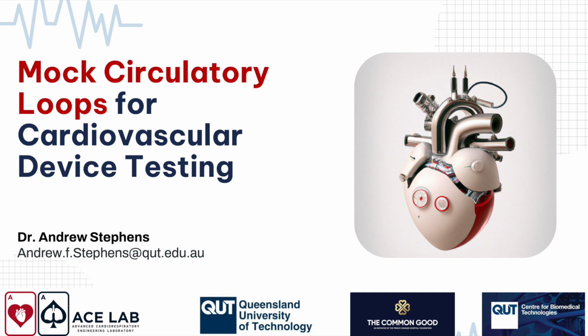But the key thing is to make sure that you pick one with a low pressure drop, because otherwise you'll be losing a lot of the work that the heart is doing across the valve, and that energy won't be transferred to the body, and it won't deliver as good blood flow around your mock loop. And indeed, this is exactly what happens for patients with valvular diseases. So unless you're trying to simulate a sick patient, low pressure drop.